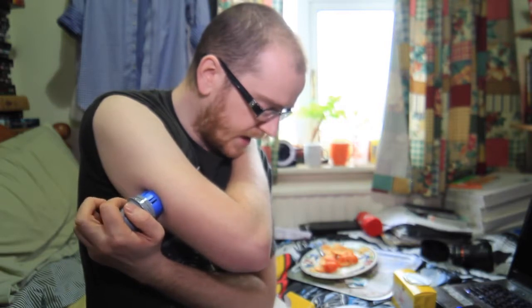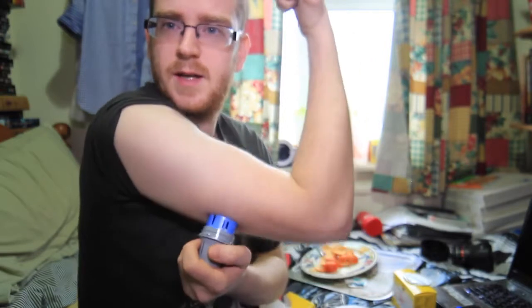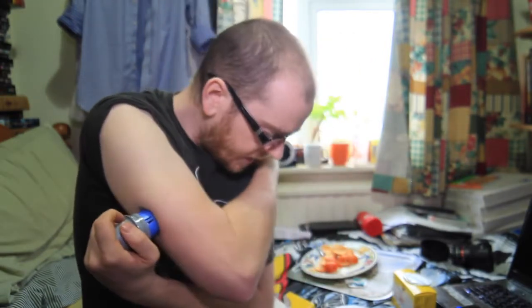Caution: do not push down until placed over the prepared site. I've got it in the right place — maybe a bit more out here. This is the scary part because it's got this big needle. Let's see how far it goes in — one, two, three, go! I can't feel anything — didn't really feel anything at all.